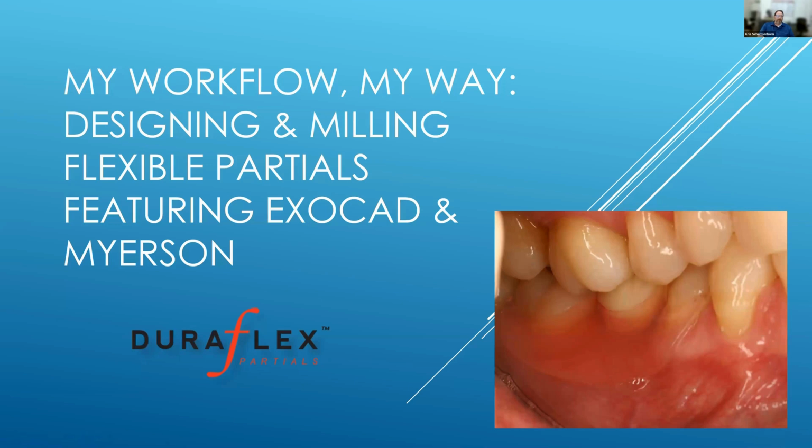Polypropylenes are nice because they have a melting point. Other plastics, like the nylons, just get softer as they get hotter when you inject them. DuraFlex actually has a melting point that's well above 300 degrees. So that's why the DuraFlex mills so nicely.